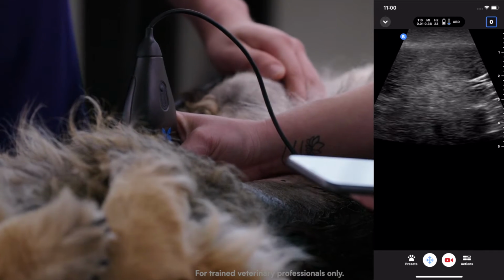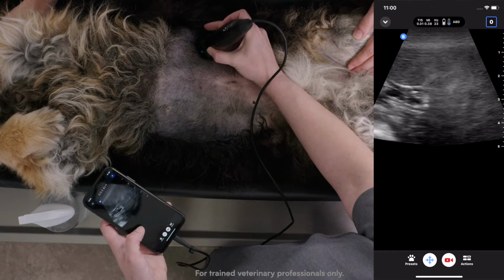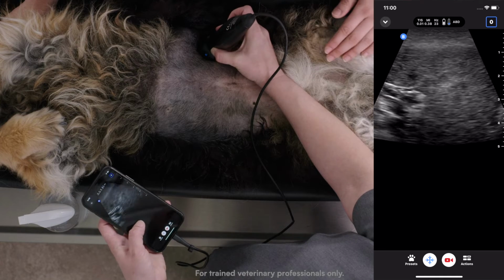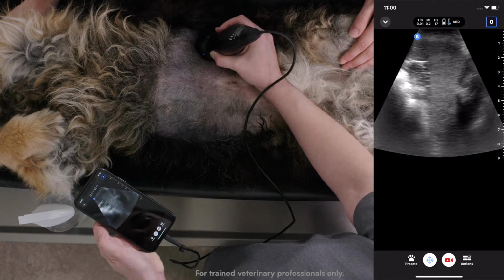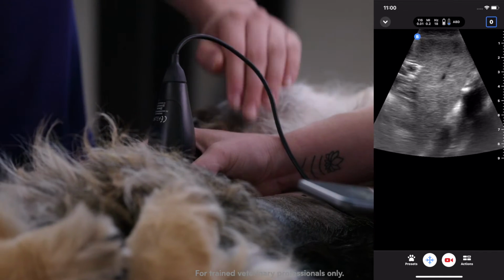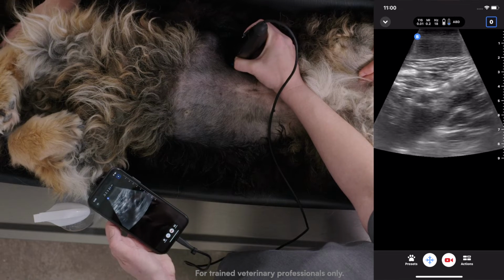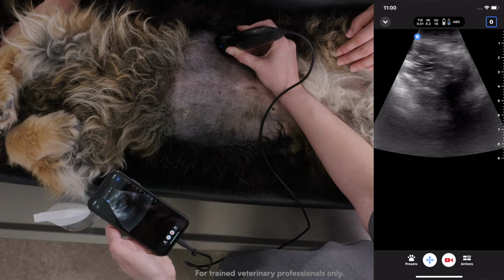We're going to keep holding tight to those left ribs until the spleen either runs out or you start to notice splenic parenchyma in your dorsal field. You'll turn into transverse, turning your indicator towards the right side of the abdomen, and adjust your depth so we can see all the way down to that most dorsal portion of spleen, being the head of the spleen. You'll fan through cranial to caudal until it fully goes away.